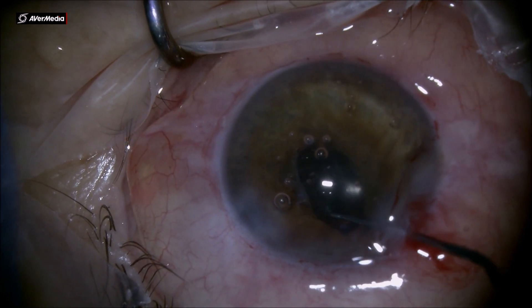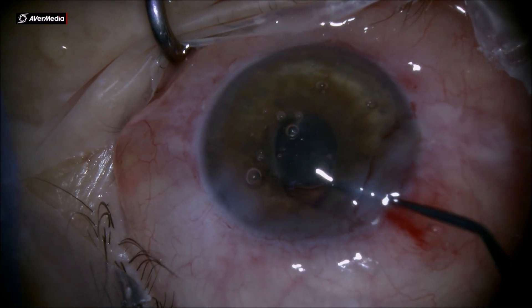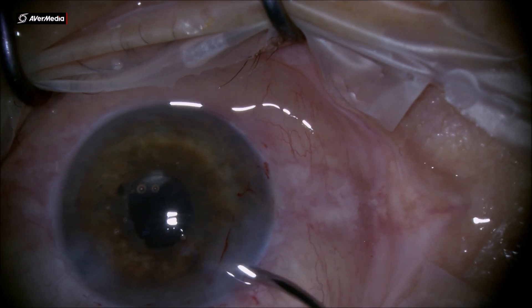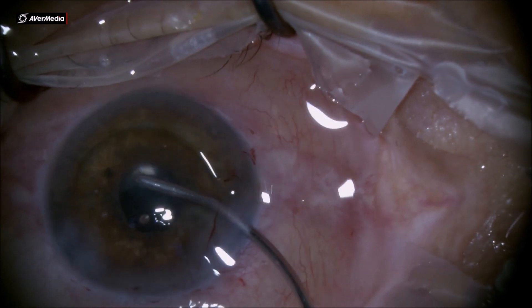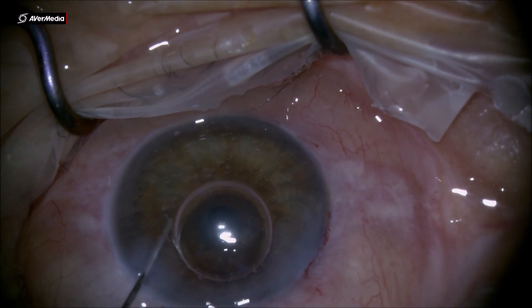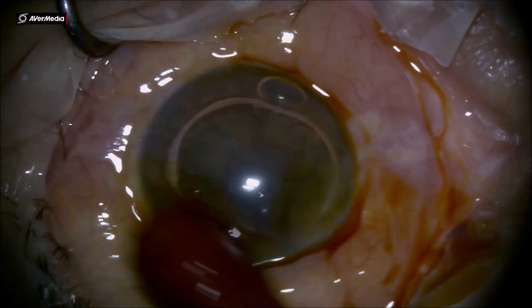At the end of the phacoemulsification and IOL injection, I clean up the anterior chamber of any viscoelastic remnants. I use the tip of the needle to push back the iris stroma, and in this way you break any anterior synechiae. In this case, having neovascularization in the angle, there was a little bleeding inside the anterior chamber, but I placed some Miochol to constrict the pupil and Avastin at the end of surgery. That's the end of the case — thank you for your attention, I hope this will help you in your practice.